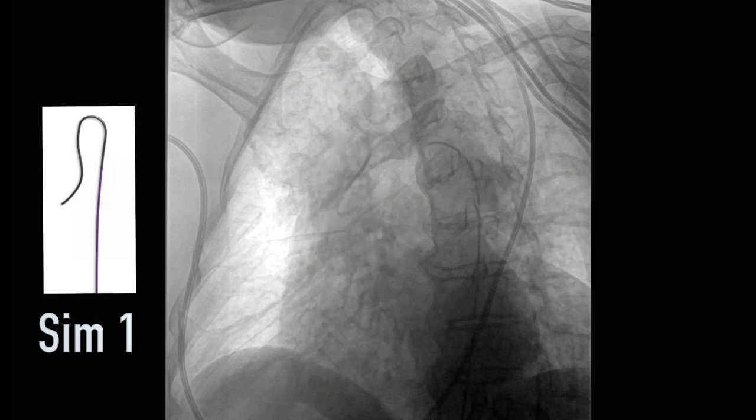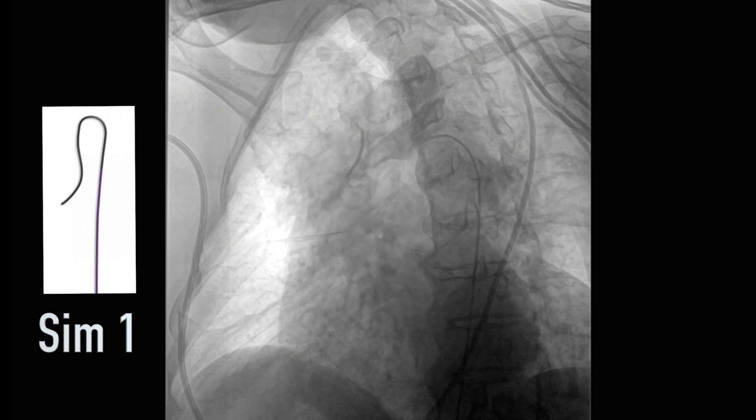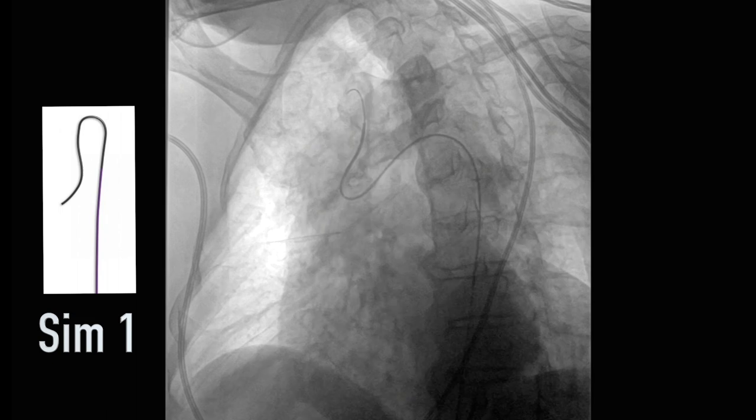These catheters come in three different sizes: SIM-1, SIM-2, and SIM-3. The diameter of the shaped catheter is sized to the diameter of the aortic arch. Bigger arches need, for example, a SIM-3 catheter.